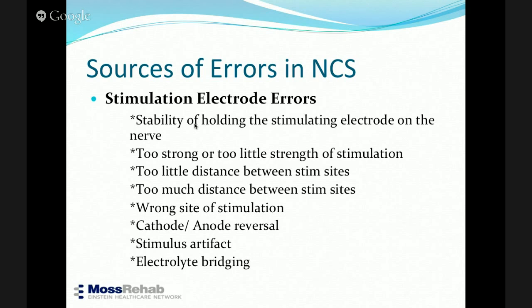Too little strength of stimulation, of course, the latency is going to be longer because you're not stimulating all of the fibers, plus the amplitude is going to be smaller. Too little distance between stimulation sites, that would cause error.